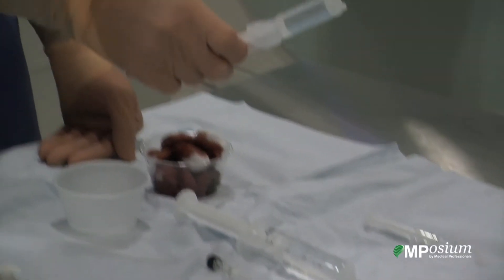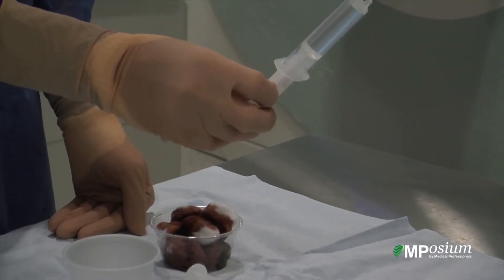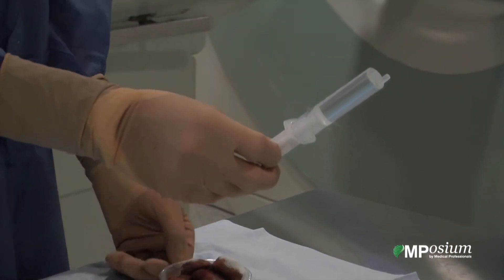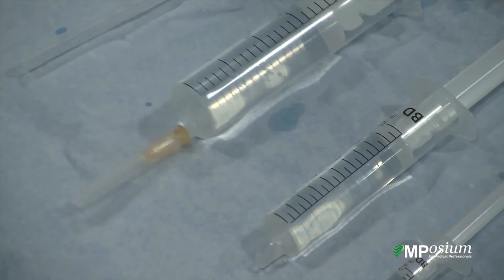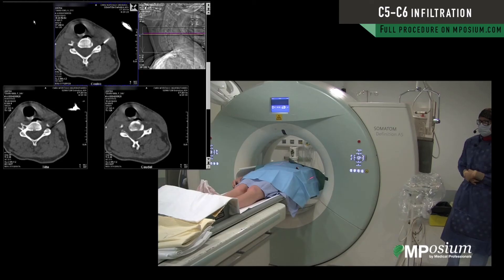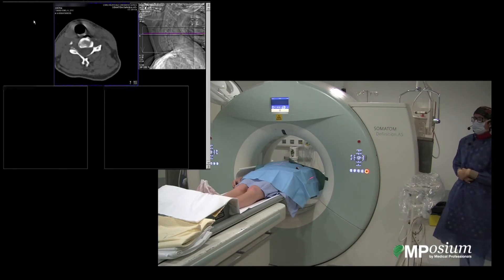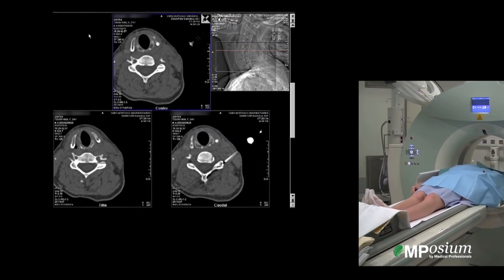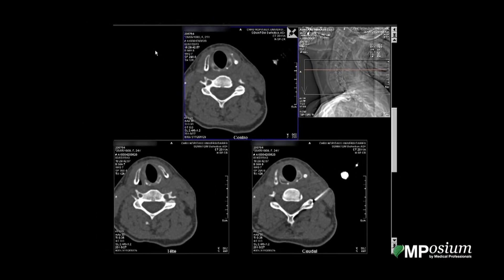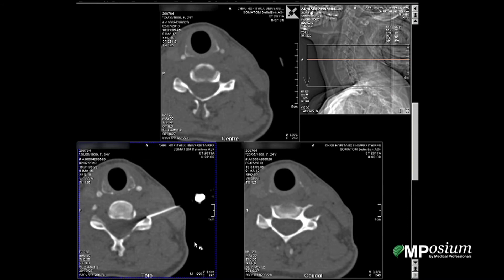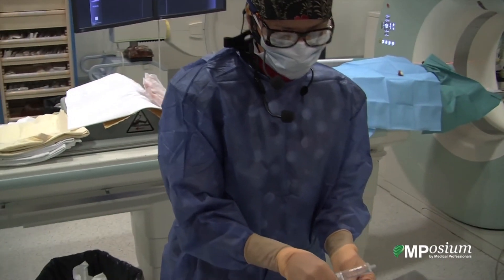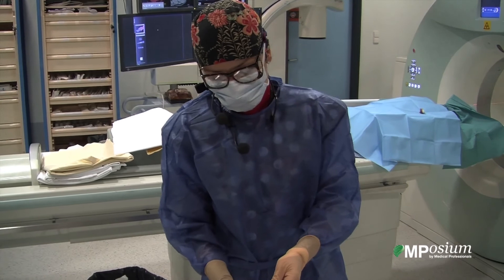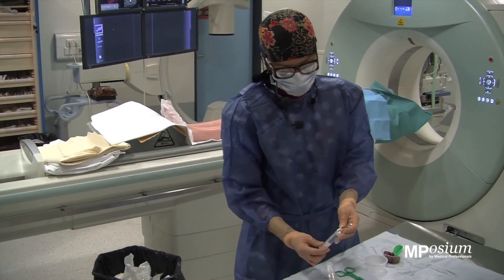We are using a contrast medium in order to opacify and verify the distribution of the anti-inflammatory medication. We are using a connecting tube in order to avoid displacing the needle once it is in the proper position.